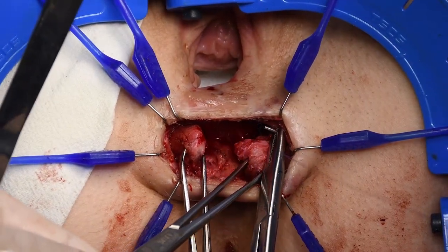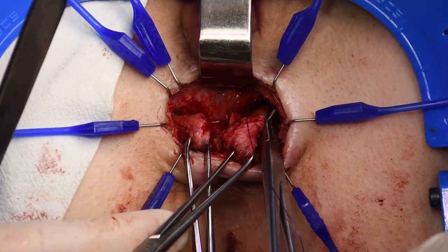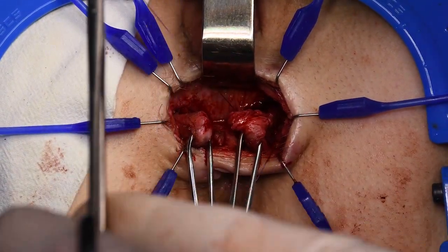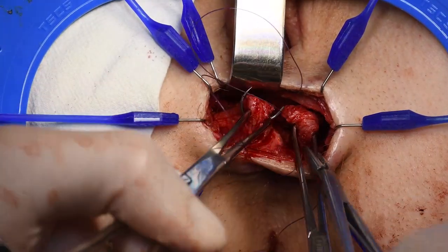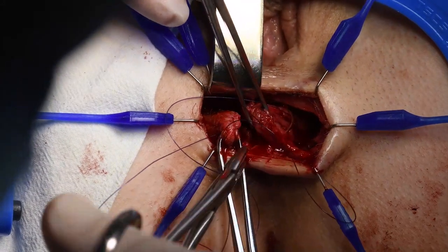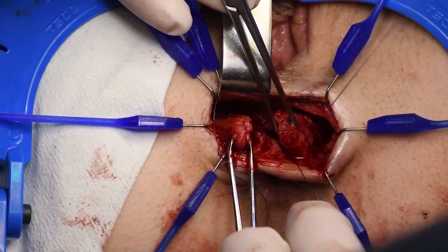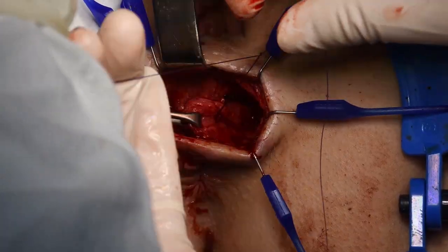Muscle suturing begins with overlapping U-stitches using absorbable monofilament. Knots should be tied carefully to prevent ischemic muscle damage.